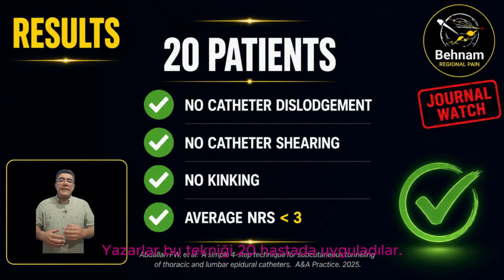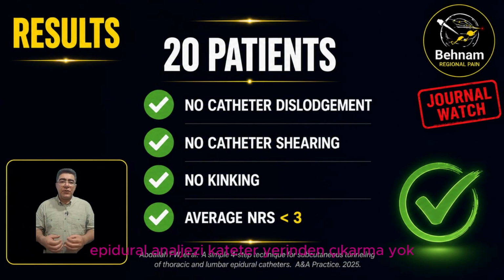The authors applied this technique in 20 patients undergoing thoracic and lumbar epidural analgesia. No catheter dislodgement, catheter shearing, or kinking was reported. Post-operative analgesia was satisfactory with an average pain score below 3.